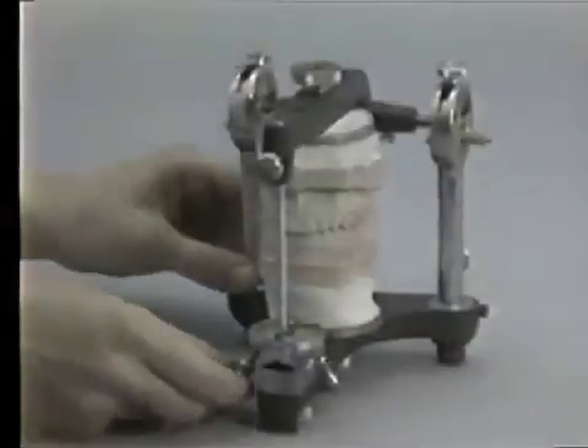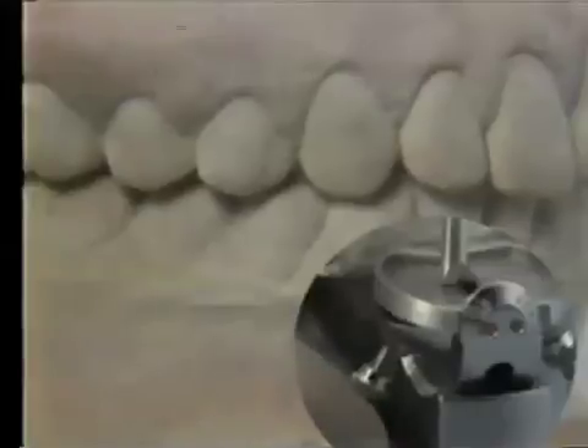If the incisal pin is not centered laterally, a change in the vertical dimension will occur when the wings are elevated.